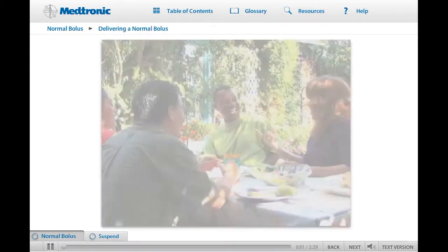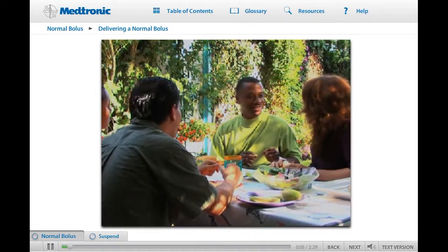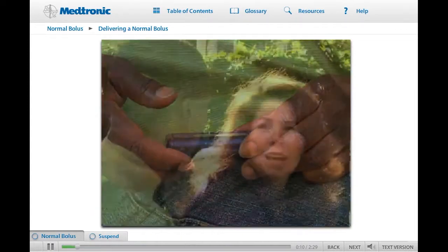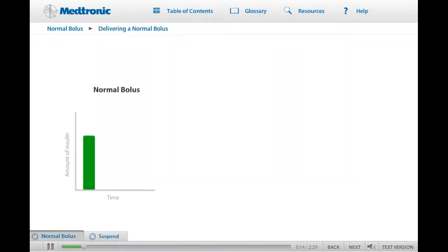There are two reasons a bolus is given. One is to cover the rise in glucose that occurs when a person eats, and the second is to correct a high blood sugar. There are three types of boluses that can be delivered with your pump: normal, square wave, and dual wave.